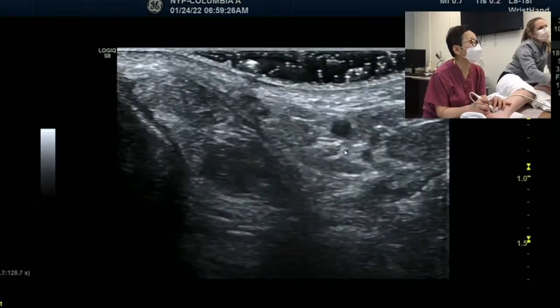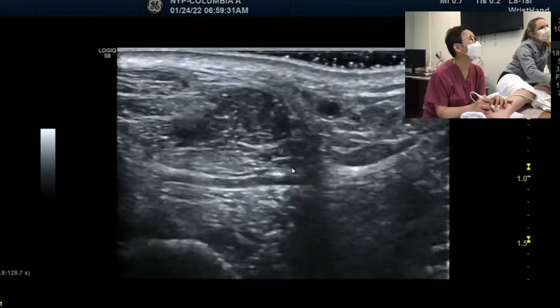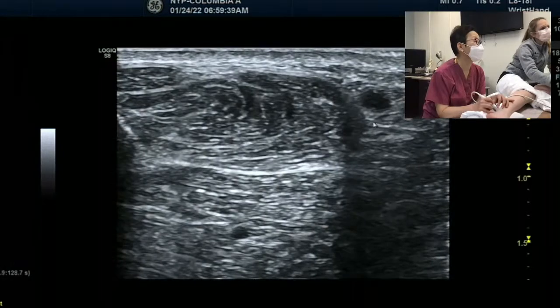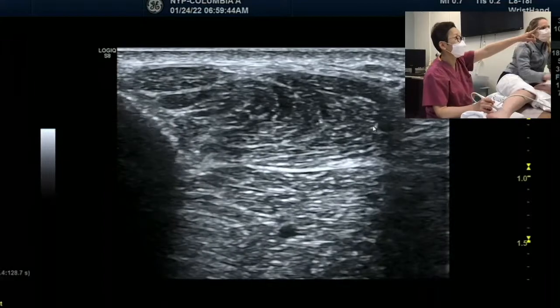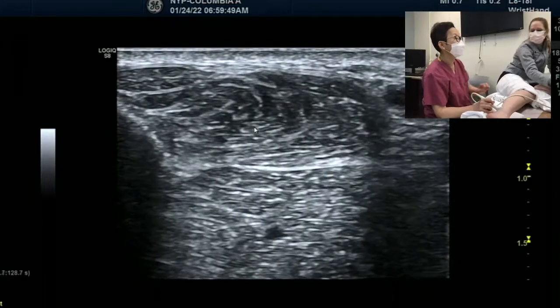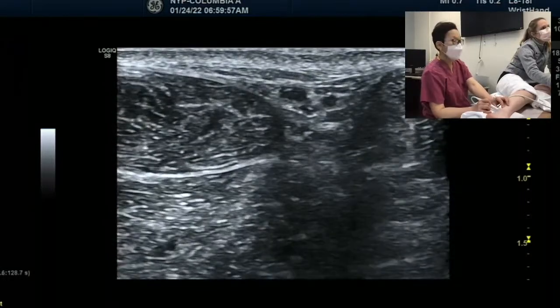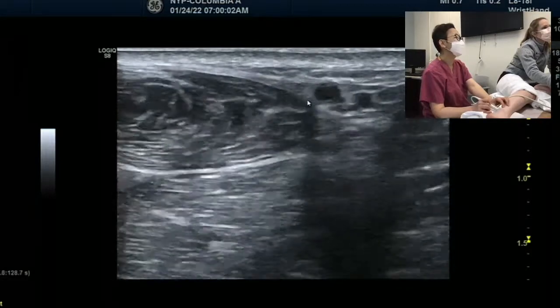Usually the nerve is always next to the vessel, so we follow. Nice. You still see it underneath, right here. Yeah, that's the sural nerve. Now, so clear. On the top left side is the peroneus longus tendon and peroneus brevis. Look at that, how big and beautiful the brevis muscle is. And then if I move in between the Achilles tendon and the lateral malleolus, it is more narrow. So you can see, let's try color flow here.